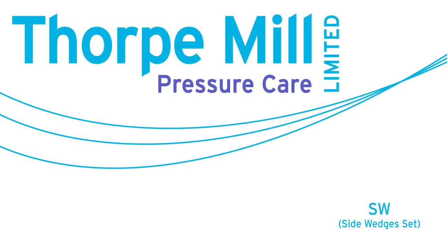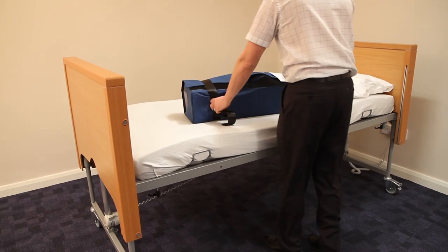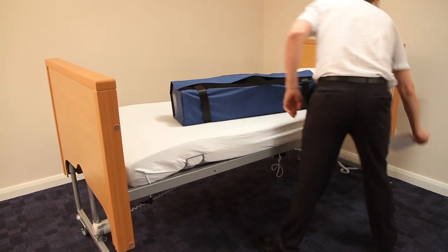These are the fitting instructions for the side wedges set, or SW. Raise the bed to the correct working height. Place the product on the bed.